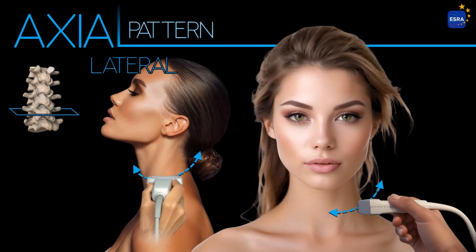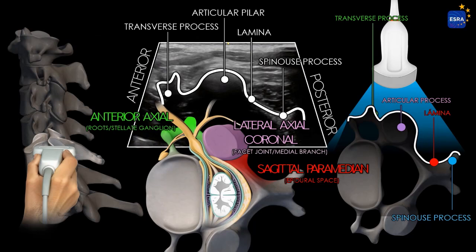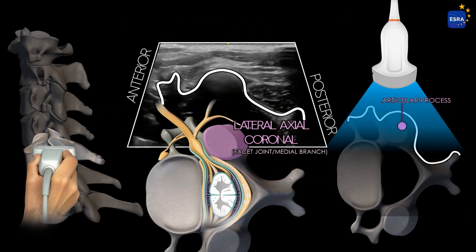The lateral axial scanning plane is useful for identifying the cervical facet zygapophysial joints, as well as the medial branch that innervates each corresponding level. Initiating the examination over the articular pillar will allow us to identify the cervical facet joint line or a section of the articular pillar, either the adjacent superior or inferior articular process. At this point, we will rotate the transducer to obtain a coronal scanning plane, a longitudinal lateral view of the articular pillars.